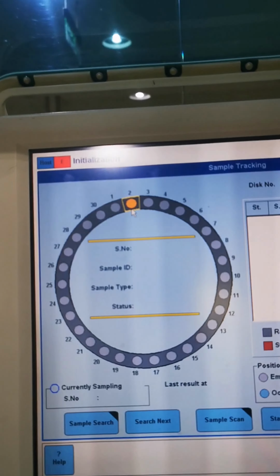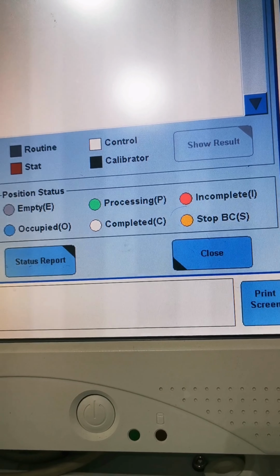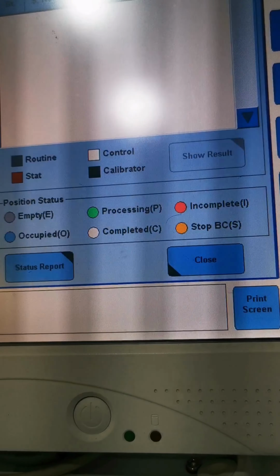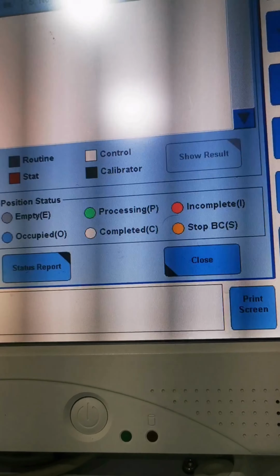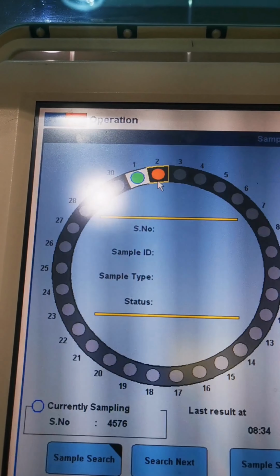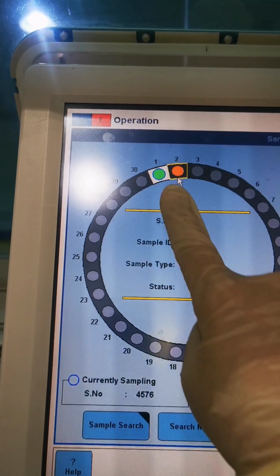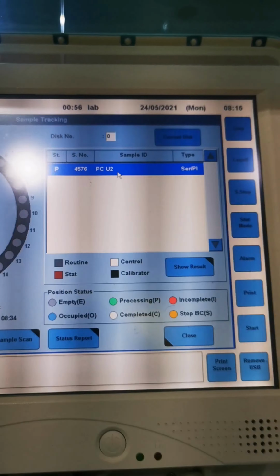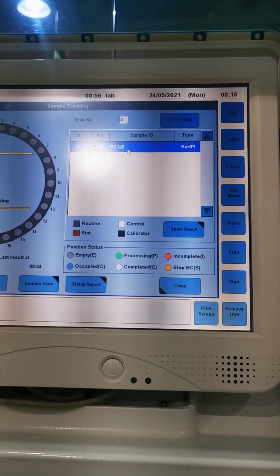You can see that the machine is still initializing and it doesn't start sample scanning yet. So wait for some time until the machine is in the operation mode. After some minutes, check the sample tracking again. As you can see, the number 1 position is in color green, and it means that the test is processing.